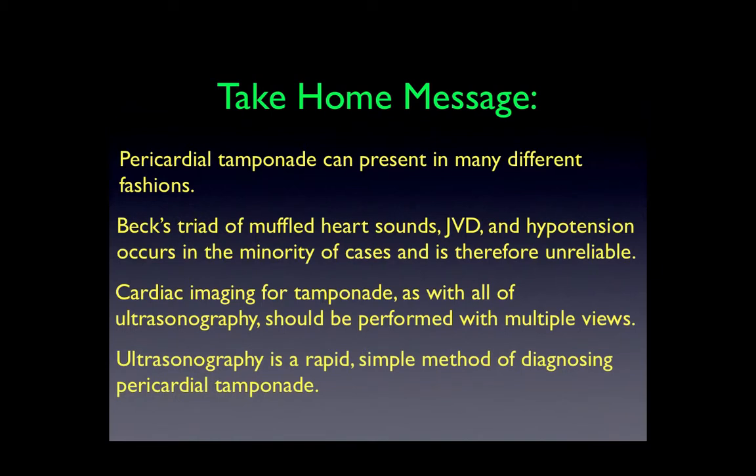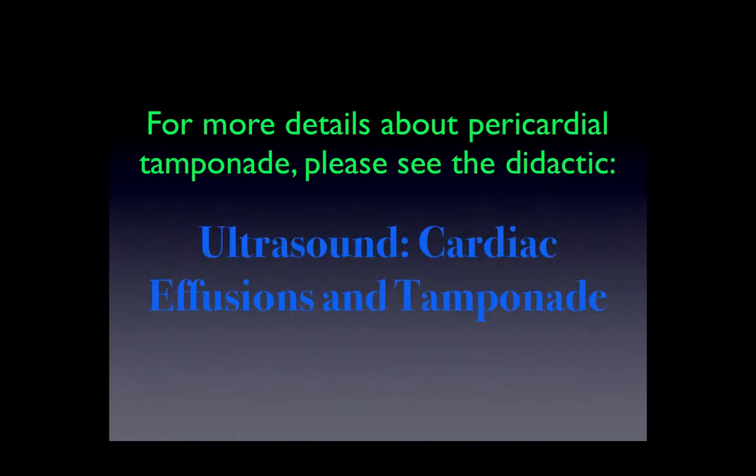Ultrasonography is a rapid, simple method of diagnosing pericardial tamponade. For more details about pericardial tamponade, please go back to the didactic lecture entitled Ultrasound, Cardiac Effusions and Tamponade.